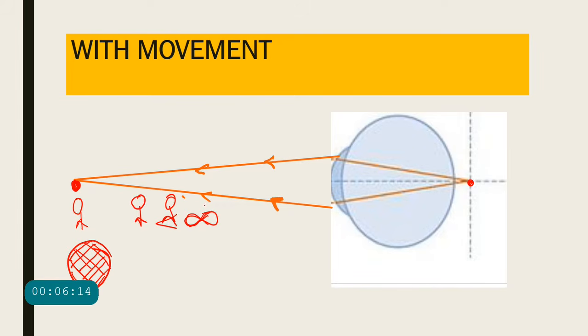Okay. We are going to land up sitting somewhere here. So if we sit somewhere here, what will happen? We are going to actually see the light rays which are coming, and what will be the orientation? They will seem to be converging towards a point, right? So if we sit over here towards the down part, we are going to see the down part of the retina, the lower part of the retina. If we sit somewhere near the upper rays of the retina, we are going to see the upper part of the retina.